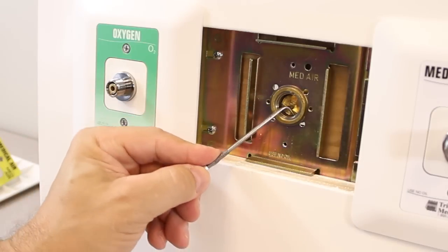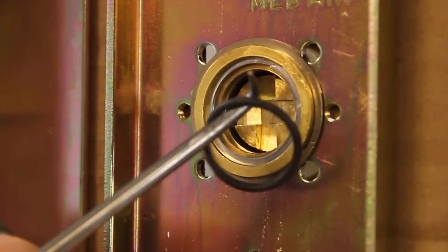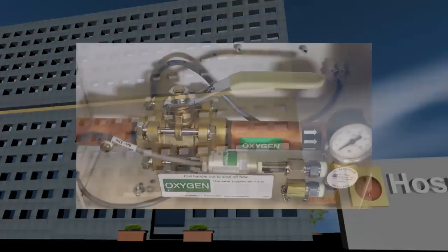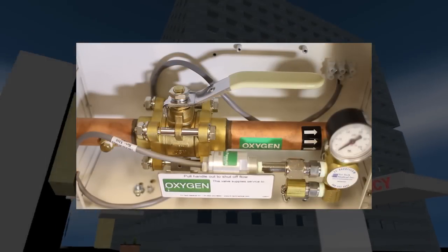To maintain a Tritec outlet, simply remove the outlet front and replace the O-rings. The gas system does not need to be shut down.